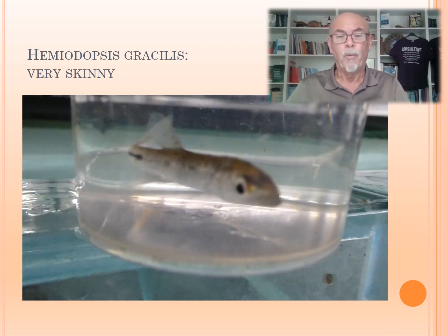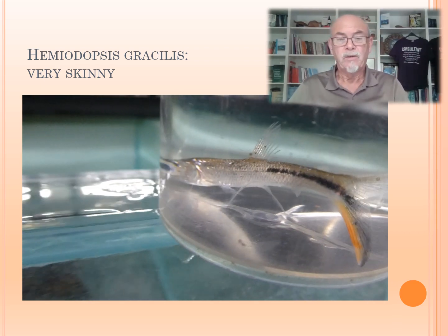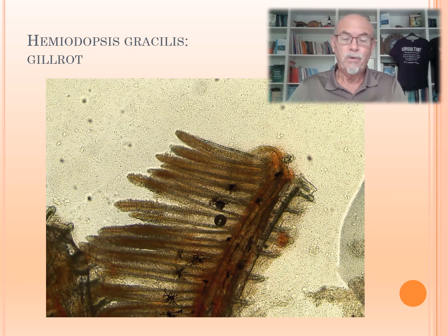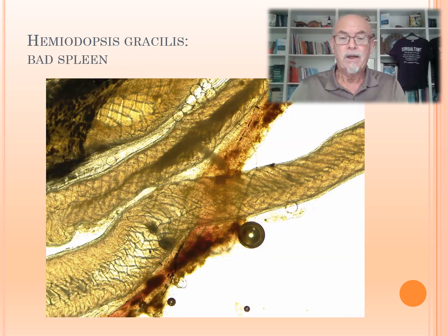Sometimes it can happen with wild fish that they are exhausted and had certain problems. So it's time for us to do an examination. And we found in the gills some parts with gill rot. You can see here the parts where the gill lamellae have disappeared, usually by bacterial infection. And we also found Metacercaria worm larvae taking away healthy gill tissue, and that's creating a problem.